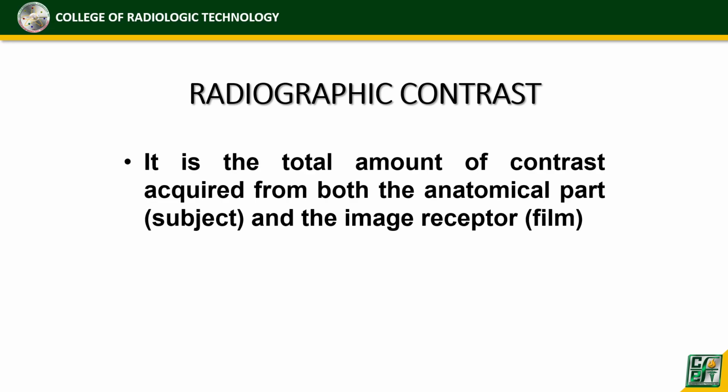We have the subject contrast and the film contrast or image receptor contrast. Okay? Pero kapag ang nakita nyo ay radiographic contrast, it is the sum of both the subject and the film contrast. Yung kabuuan ng pagtingin natin sa image sa ating radiograph, yun yung radiographic contrast.